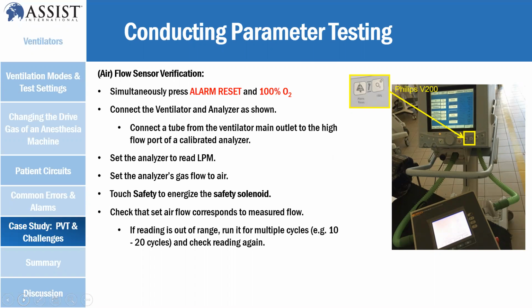Then touch the safety to energize the safety solenoid on the ventilator. Depends on the model. Some are using different types of key. These are fully followed according to the service manual. Check the set airflow and correspondent to measurement flow.